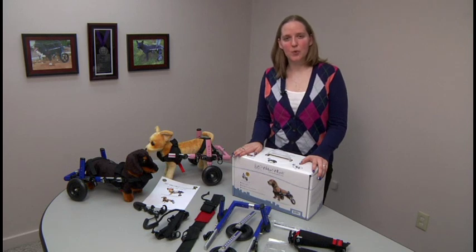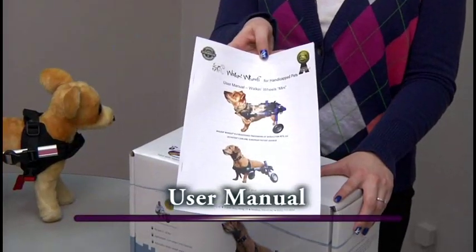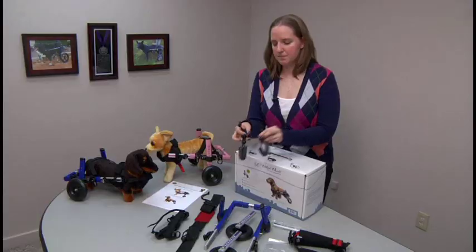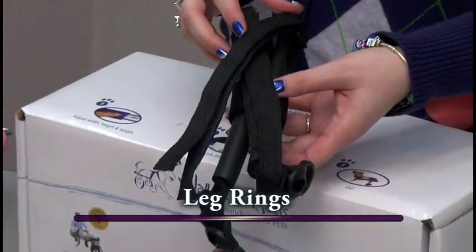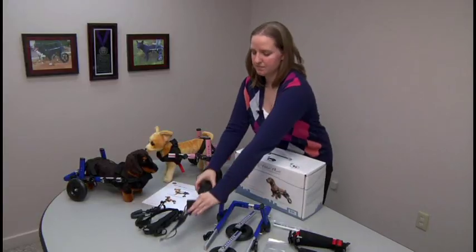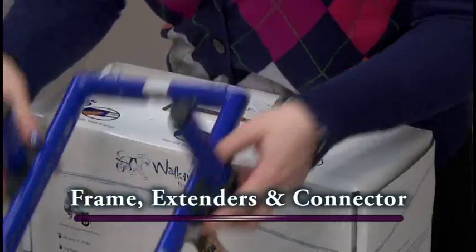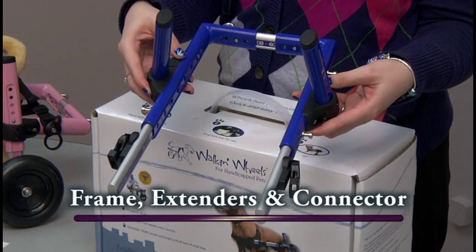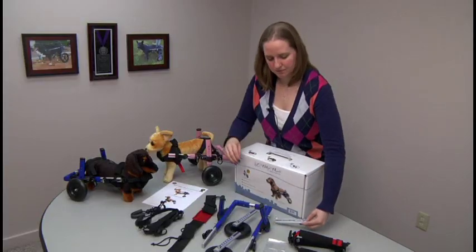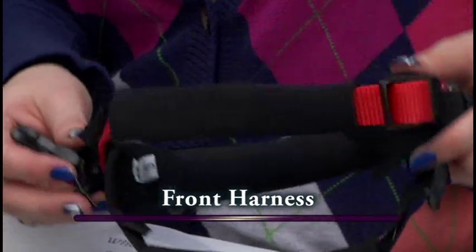My name is Terry and I will be going over what comes in the box for the award-winning Walking Wheels. This is the box that your wheelchair will be coming in. This is the user's manual for the mini Walking Wheels. These are the stirrups, the leg rings, and the belly belts. These are the wheels that have the struts already attached to them. This is the frame for the mini — it has the extenders already in it as well as the connector. It also comes with a wider connector for dogs that are a little bit wider. Also included is the allen key with the set screws as well as the front harness.